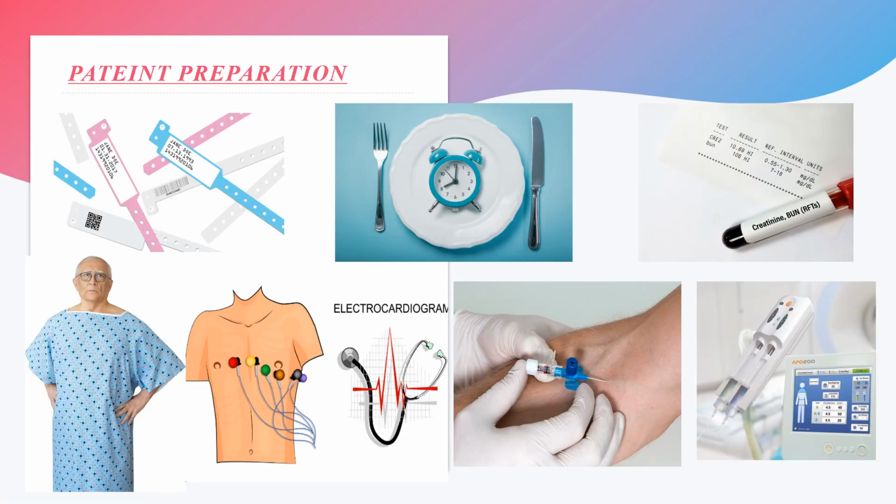Now, how will you prepare a patient who will undergo a CT urography examination? At first, you will check the UHID of the patient, that means the unique hospital identity. Then you instruct the patient that he or she has to be fasting for 4 to 6 hours. Then you will check the creatinine and BUN report of the patient.